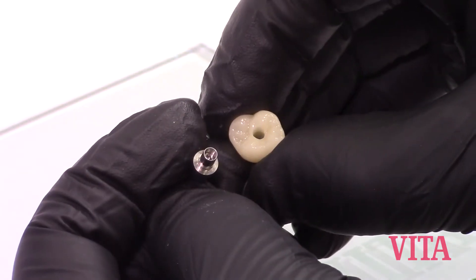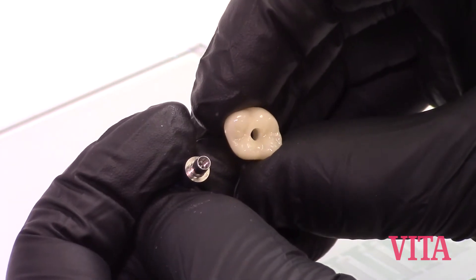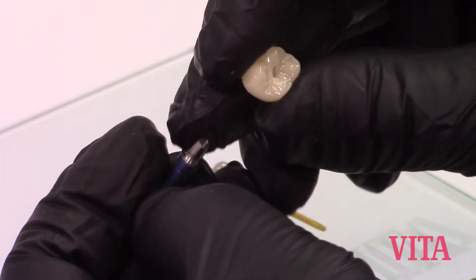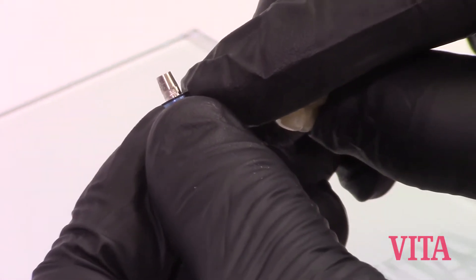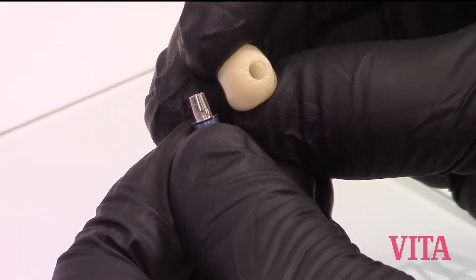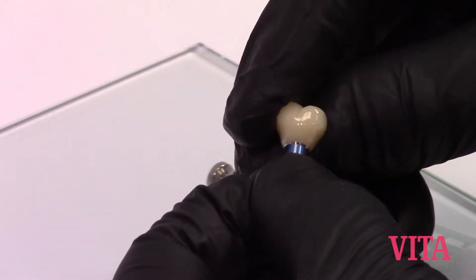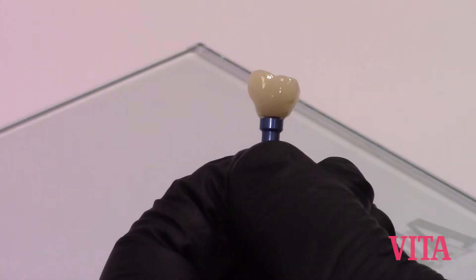Take your finished restoration — ideally you would polish it with Enamic stains, glaze, or hand polish it. Position it over the tie base. Your tie base has a very small notch on the axial wall that has to be lined up to the milled-out notch inside the crown, the chimney. The connection between the implant replica and your tie base — the collar of your tie base — must be flush.